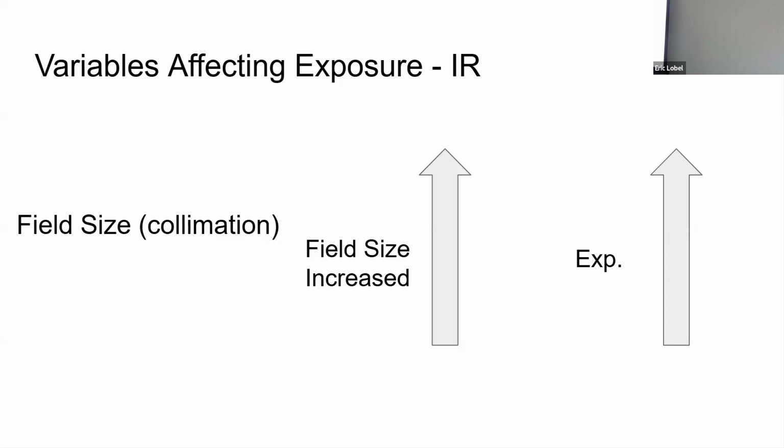Our kV levels are still not high enough that we will lose 100% of the beam. Imagine if you had a 500 kV machine and blasted through the patient completely, and you get no absorption. So what you get on your image is just black, right? So within reason, general increases in kV are good, but not that much.